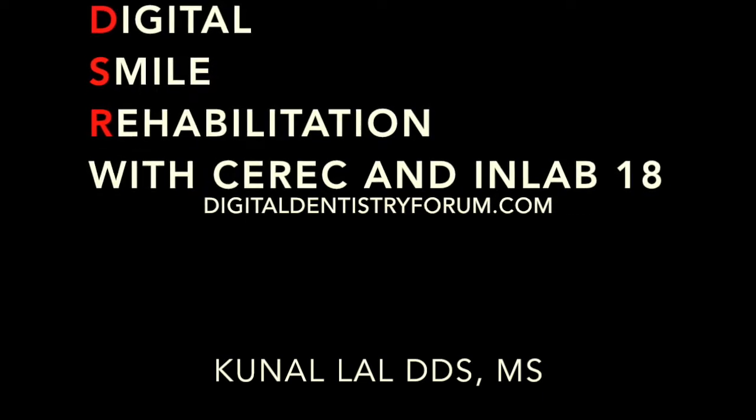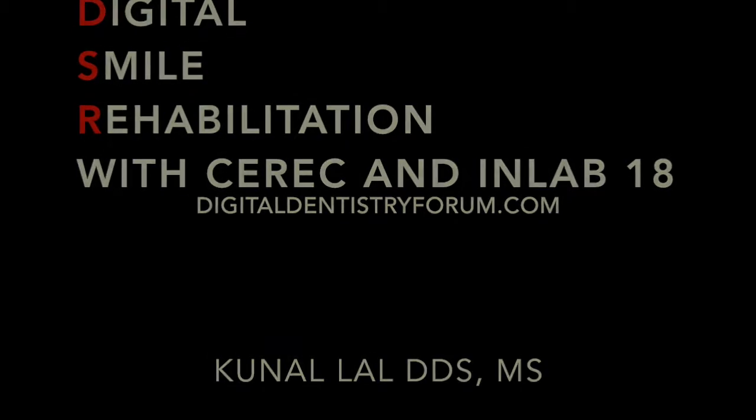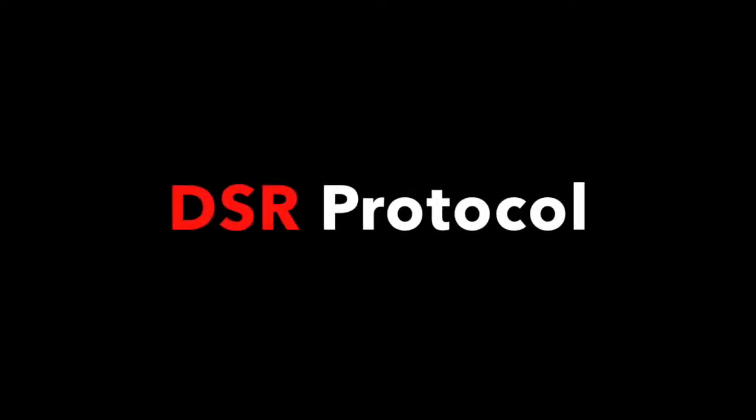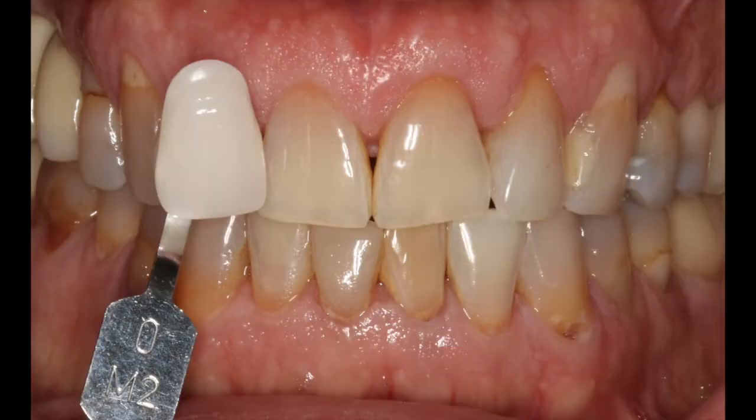Today I'm presenting a case of digital smile rehabilitation with CEREC and inLab. Why rehabilitation? Because there's a lot more to doing these cases than just design. Here's a patient with intrinsically discolored teeth. He wanted his teeth to be very light in color.